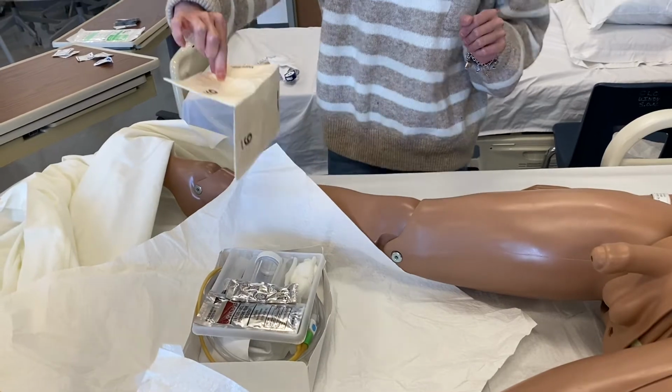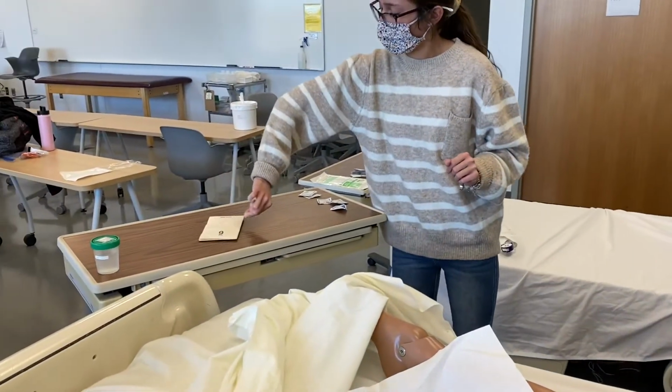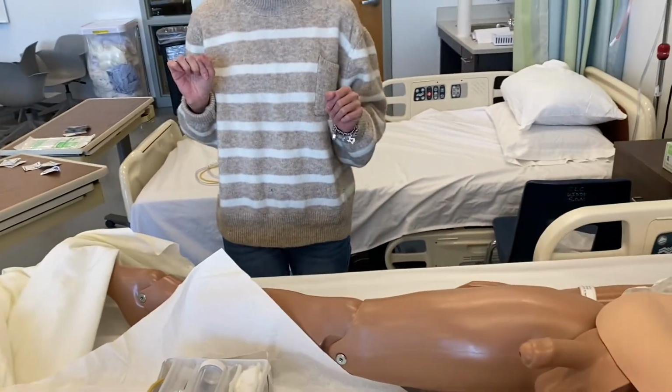Pinch my sterile gloves. Over there. Okay.